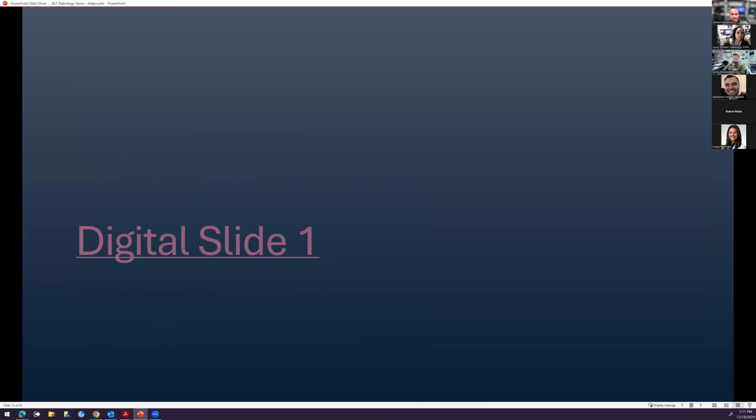But let's go ahead to our first slide. So we're going to give this a shot here and hope that it works. And I'm just going to log into my thing here real quick, and I'll move this over. Okay, so we're going to look at our first.